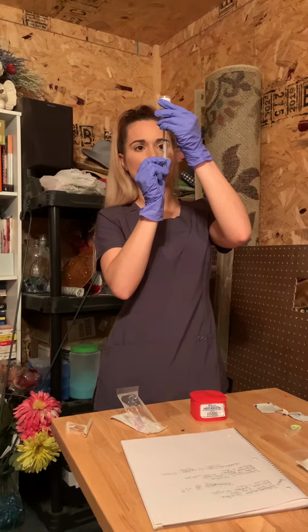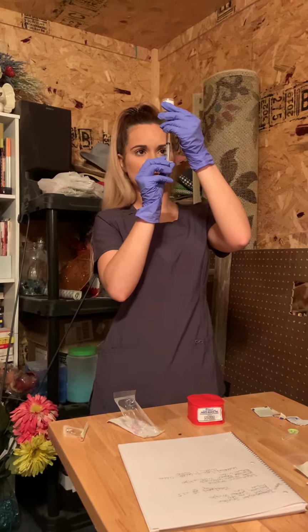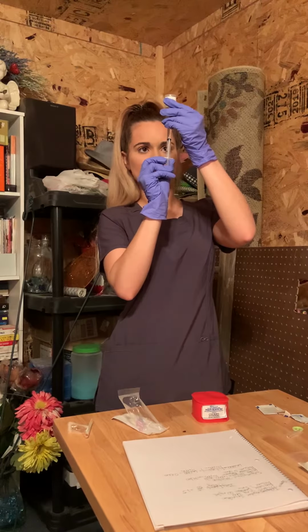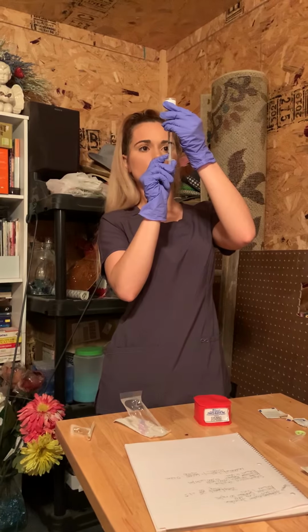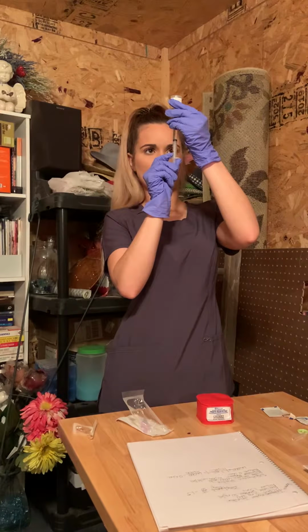You will hold it at a 90-degree angle, eye level, and you want to make sure there are no air bubbles. If there are, you can tap them out. If you can't tap them out, you can insert the air back into the vial. Just make sure the medication does not go back in the vial as well.